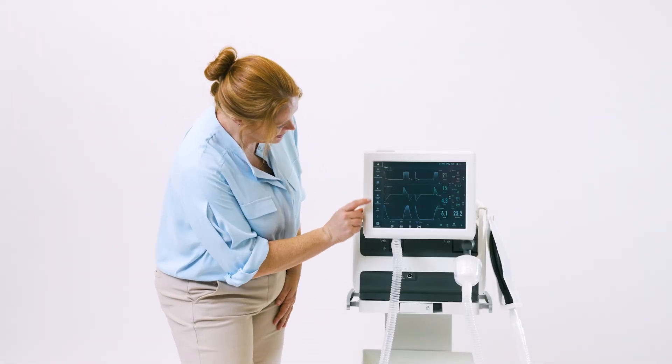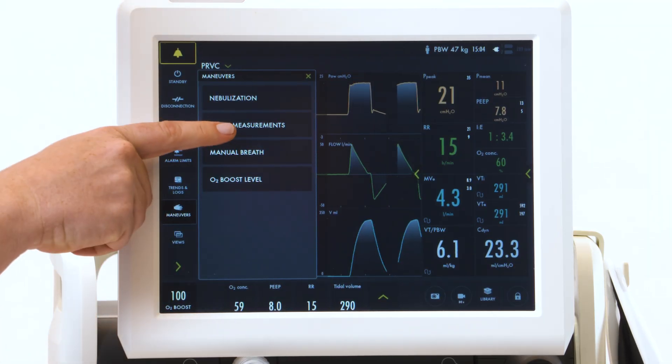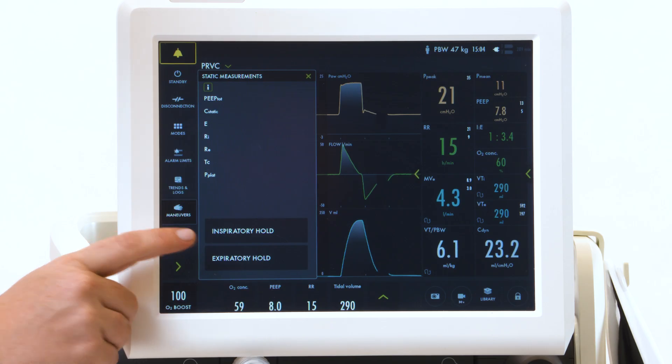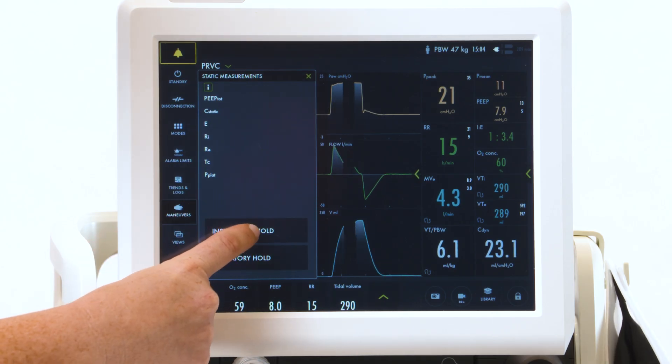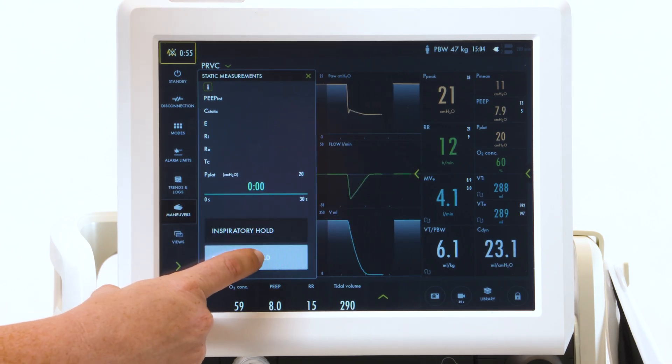Your inspiratory and expiratory hold are located underneath your maneuvers tab. Touch your maneuvers and select static measurements. This is where you can get measured values based on these holds. To activate an inspiratory hold, touch and hold until it beeps and says active for a second or two.